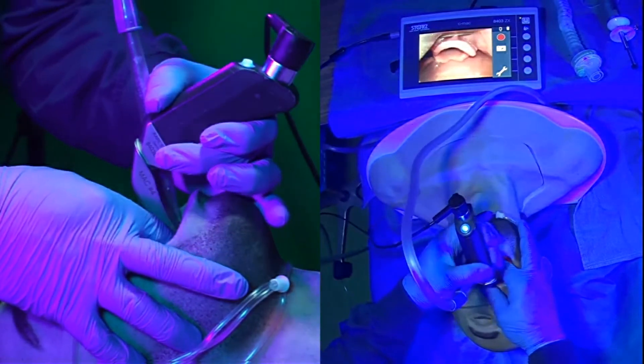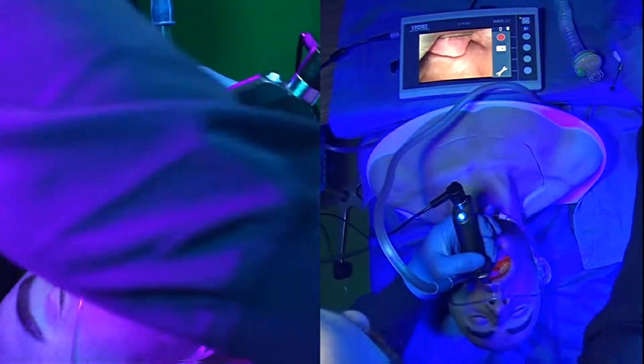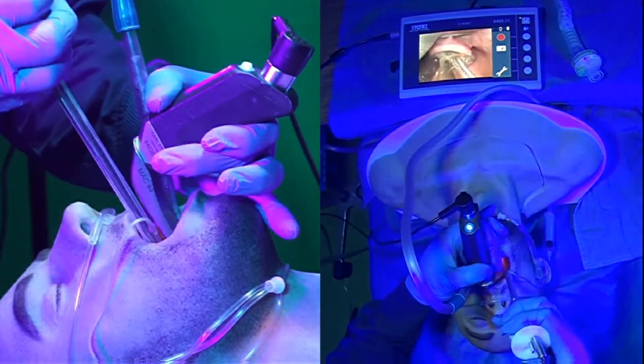By pinning that into the hypopharyngeal space, we can get our good visualization for intubation. Go ahead and pass our tube.